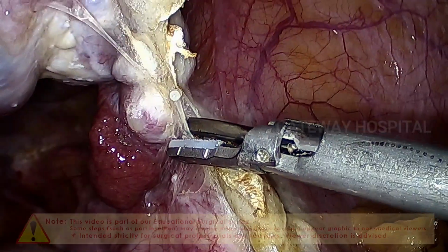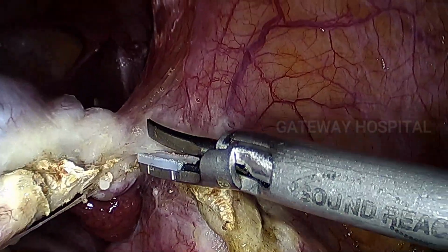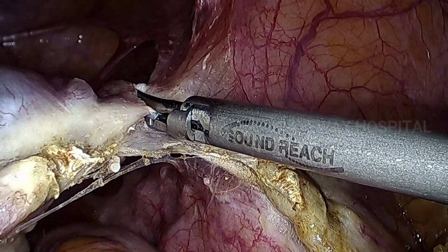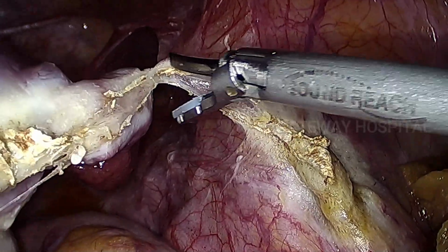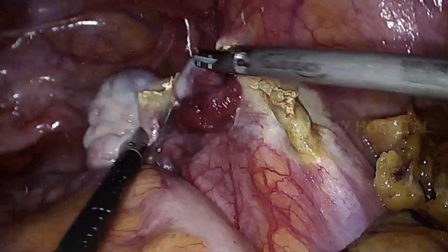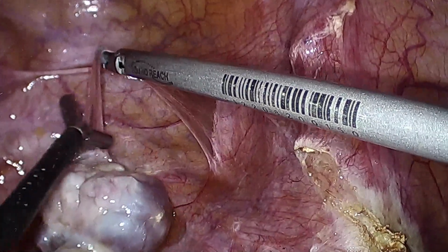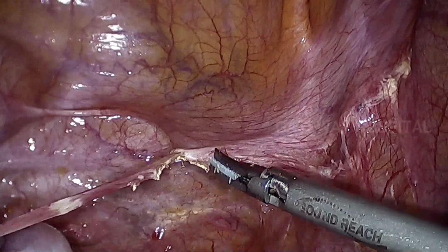You can appreciate the main vessel has already been sealed and divided, and what we are doing is just division of the peritoneal attachment. So now we are done with the division of the infundibulopelvic ligament. There is a strand of attachment to the bladder peritoneum that is also carefully divided in order to free the specimen. This is the right tube and ovary.